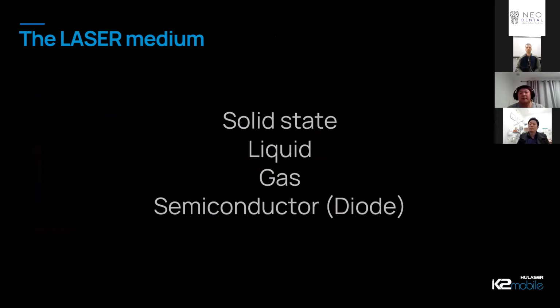And so like Raf said, they're becoming more popular in recent times, and I think around the world there's a big trend for lasers. And I'll highlight some of the uses for these as we go along. But if you're expecting to use this laser to cut teeth and bone and things, then I'll save you the hassle and let you know, unfortunately, this isn't the right webinar or the right product for you. But as a soft tissue laser, that's where it shines.